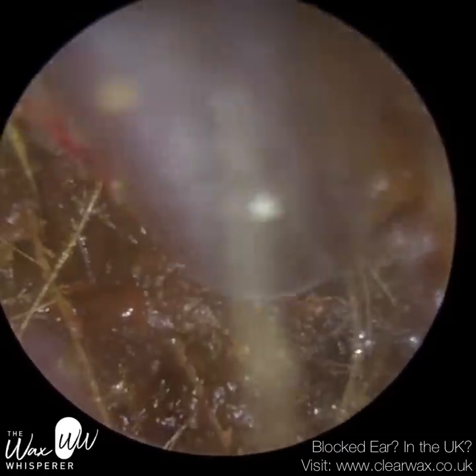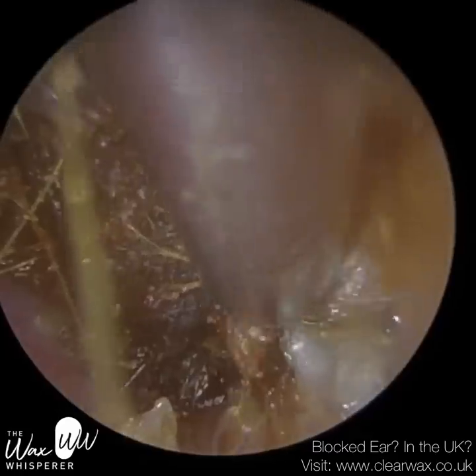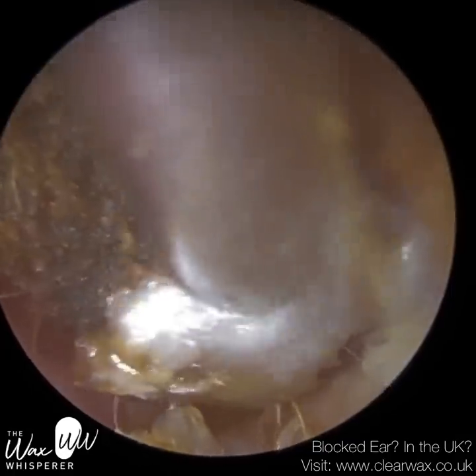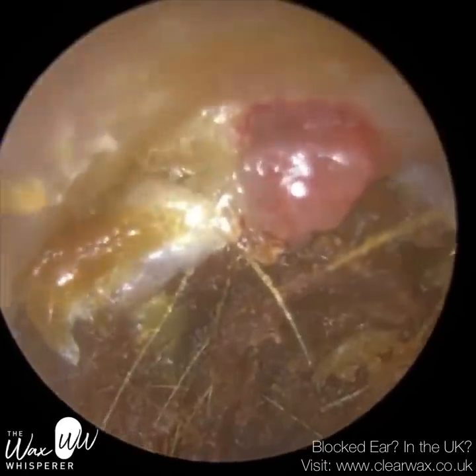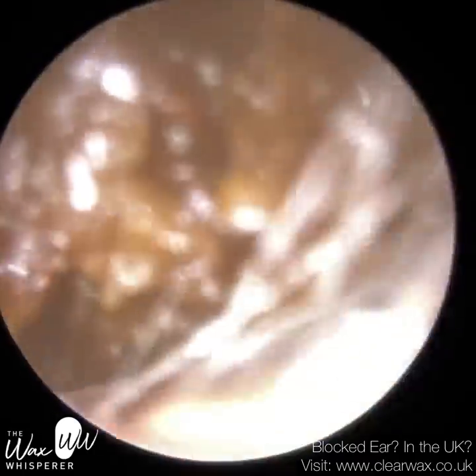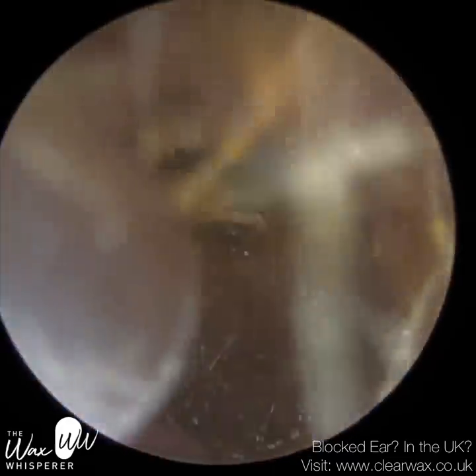The reason for the granulation tissue in grade three — can you see that? That's granulation tissue, created by the skin plug applying so much force against the ear canal wall that it's causing trauma. In response, the body produces granulation tissue, sometimes called inflammatory cells, as part of the healing process. It's a build-up of connective tissue with a bumpy red surface, and this granulation tissue can develop its own blood supply. Grade four is the most extreme form, where there's so much widening that the ear canal merges with the mastoid bone behind the ear, and patients typically need surgical intervention.